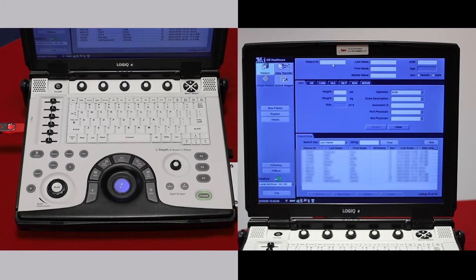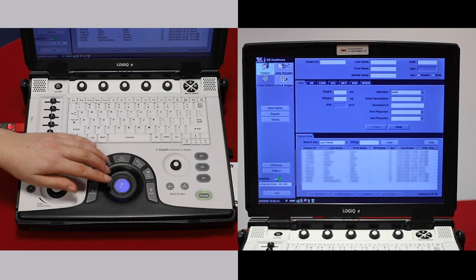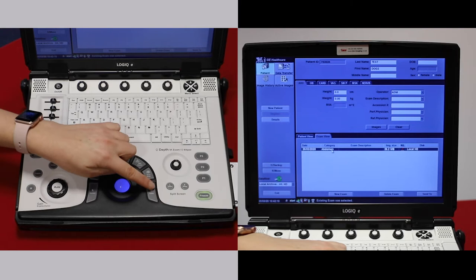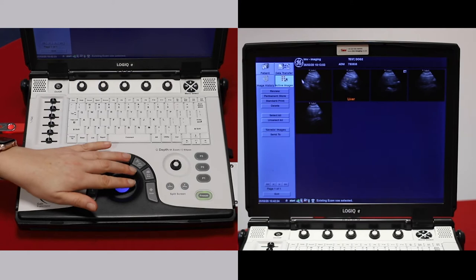To export images, find your patient as before and double-click with the Enter key. Again, either double-click with the Enter key or go to Active Images. Select the images you would like to export, or you can select all.